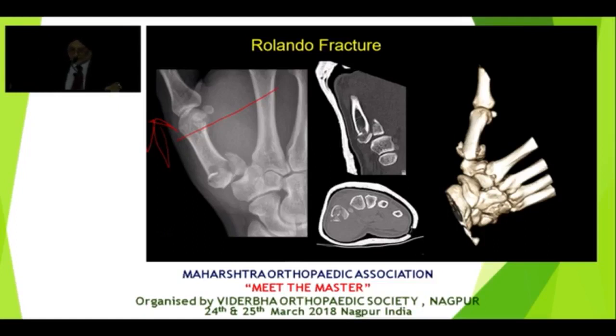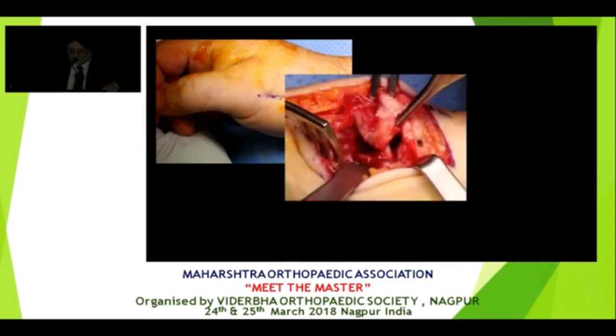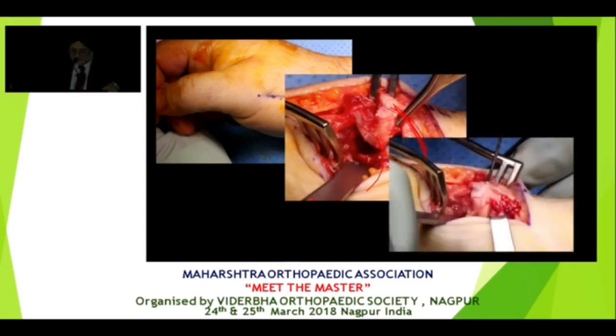However, if you like to play with small screws, the CT scan tells me I've got one piece, two pieces, and the shaft, so I can plan my surgery. This is a volar, the Gedda-Moberg approach on the volar aspect of the thumb. The thenar muscles are elevated off the bone, and here's the dorsal fragment. The APL tendon is inserting onto that dorsal fragment. Now what we've done is put a K-wire and fixed the articular portion of the fracture.